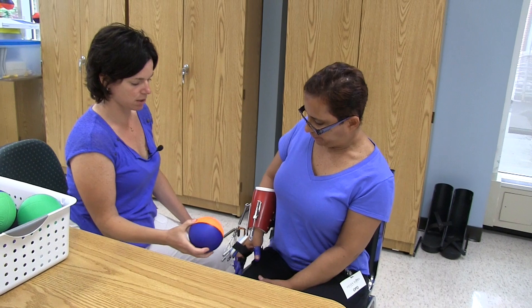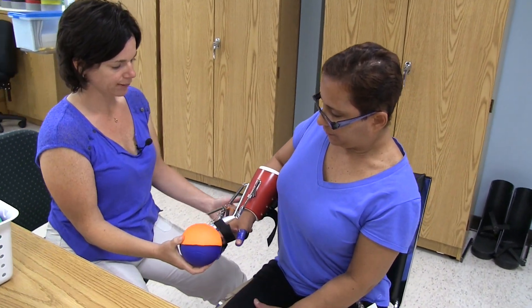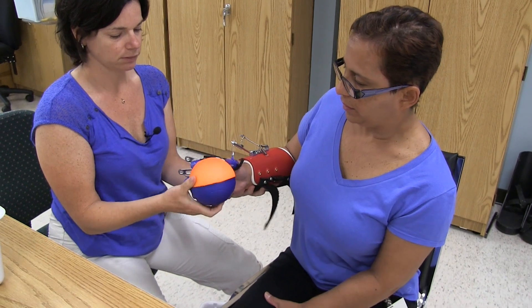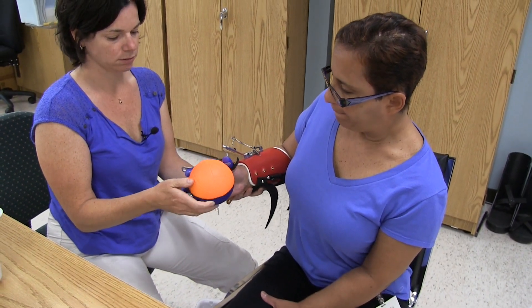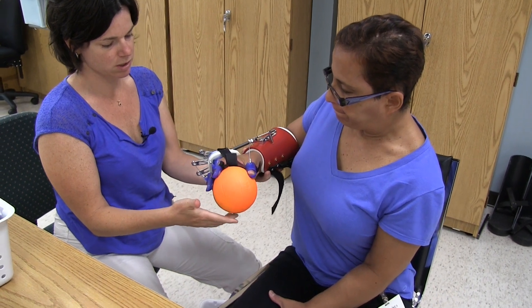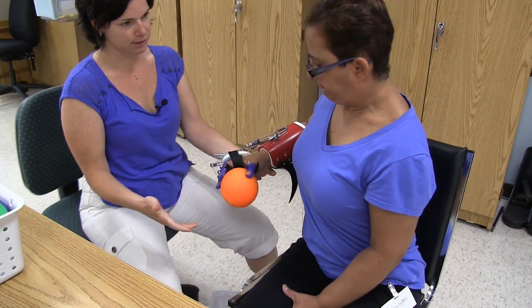With this we're just going to keep doing repetitions — high repetition. You want the ball? Ready, and squeeze, squeeze, squeeze. Good, bring it down.